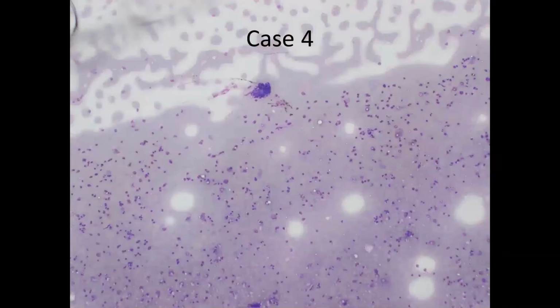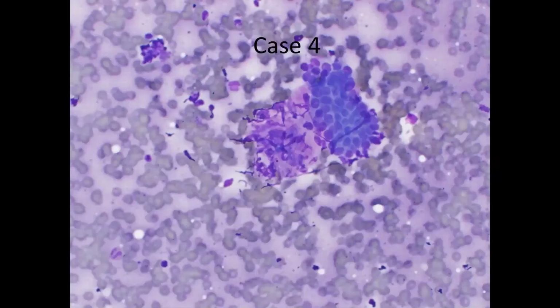And here's our final case. This aspirate is a lot more hypocellular. We have a lot of inflammatory cells in the background, maybe more than what you'd expect in just the background blood. So again, we have some crushed lymphoid cells in the background. We have, again, these clusters of bland basaloid cells, although they're kind of few and far in between, not a very cellular aspirate.